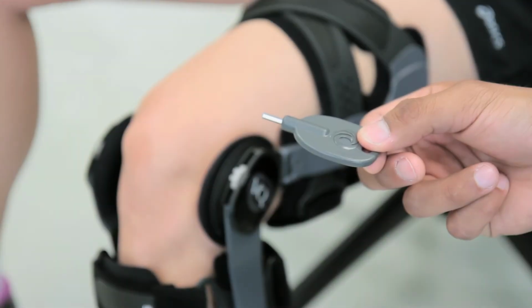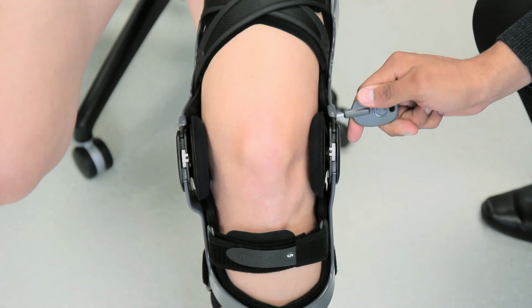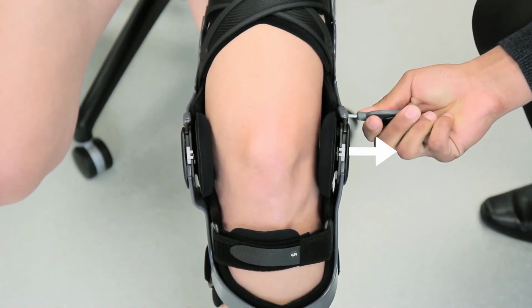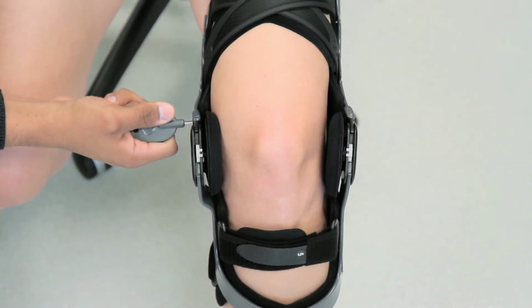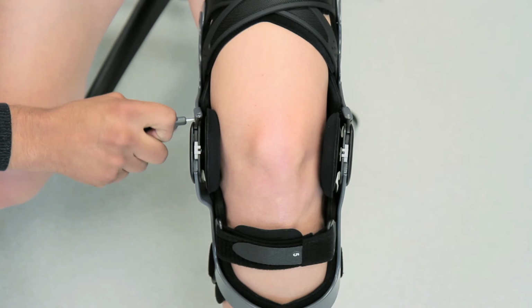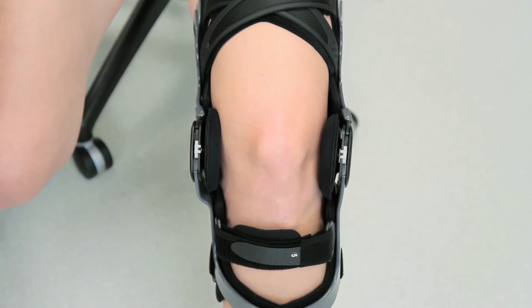While sitting, insert the patient adjustment key into the Q-hinge on the lateral or outside of the knee and turn a quarter turn clockwise. This should open up the compartment and pull the hinge away from the leg. Then insert the patient adjustment key into the Q-hinge on the medial or inside of the knee and turn a quarter turn counterclockwise. This should push the condyle pad into the knee and apply a gentle pressure or correction to the knee.